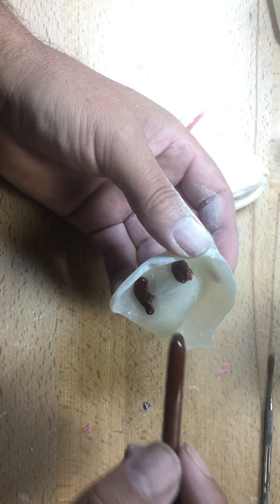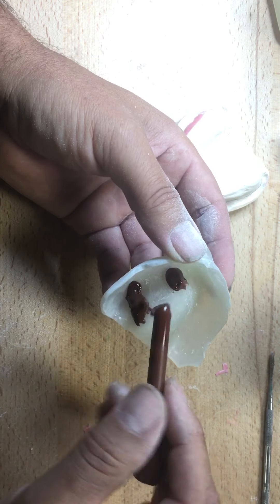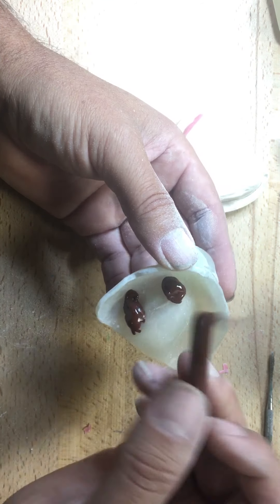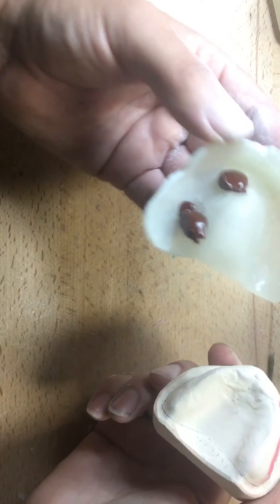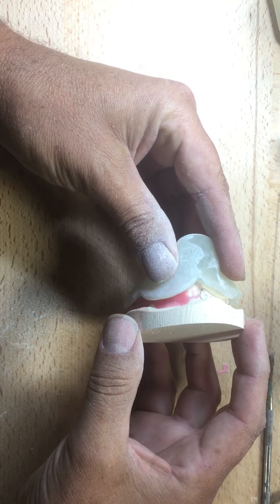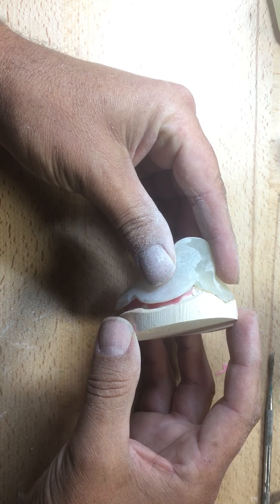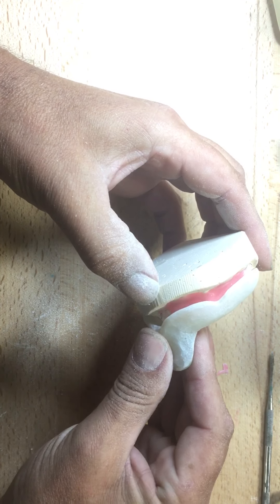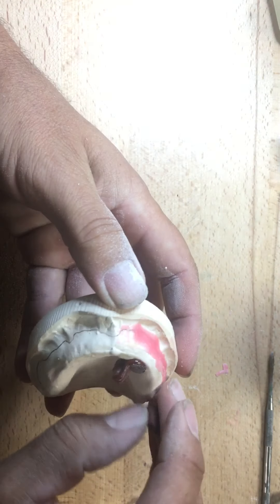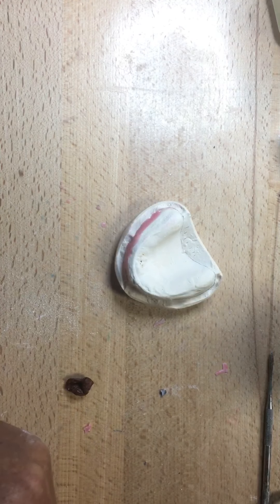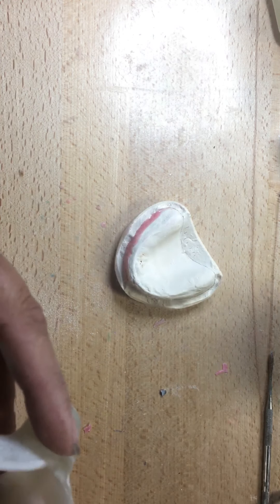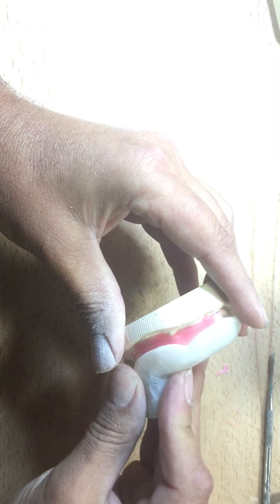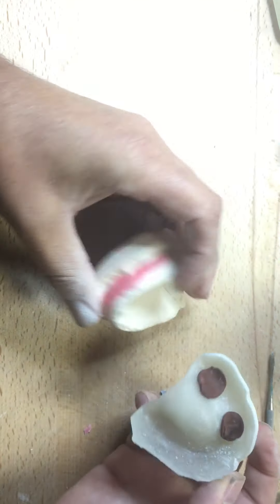Now, what I'm going to do here, which many of you are aware of, is I'm going to take the, and I'll just simulate here. Four compound stops. I'll just do two on the half here. So you can see what I'm talking about. I would generally tell the practitioner, don't do this on top of the incisive papilla or any kind of mobile tissue. So I'm kind of favoring it on the hard palate on the inside of the ridge. And what I'm going to ask the practitioner to do is when you have these four stops, this would be my first step taking a final impression for a complete edentulous client. Assuming this is the client, and this is going to be tempered in warm water. And I'll guide this in place.